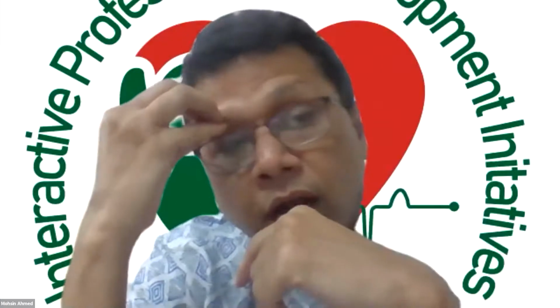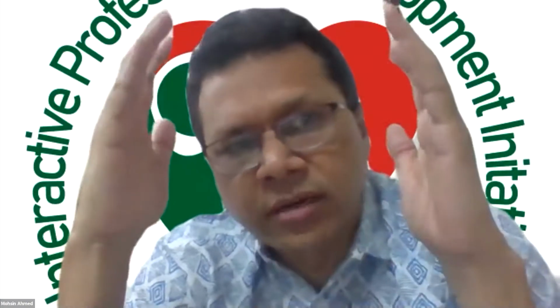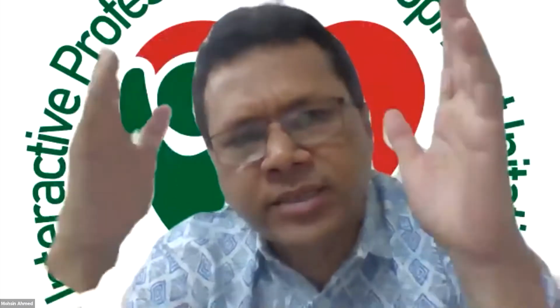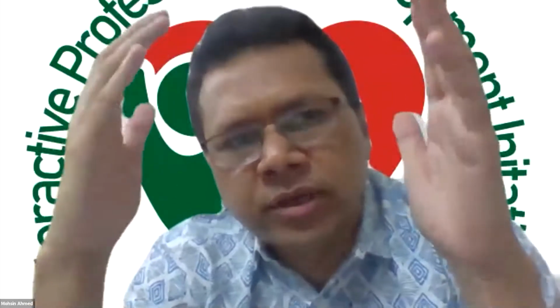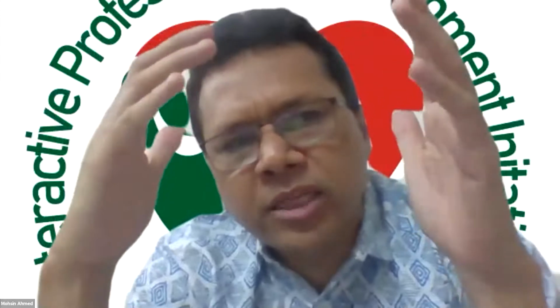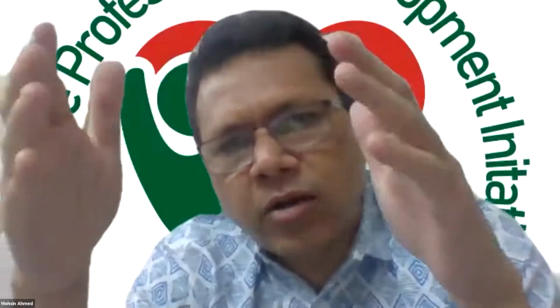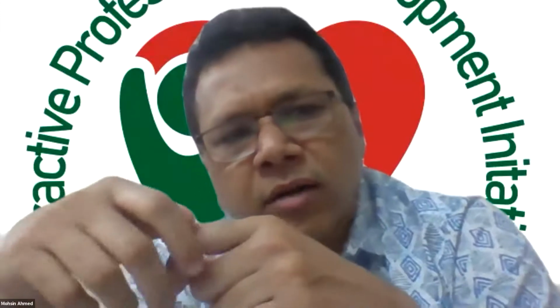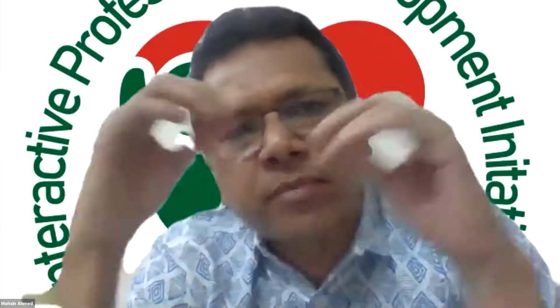Thank you, Kaisar. Another question: the microcatheter is a must in this situation. All operators should use the microcatheter, even in simple cases; you should practice with the microcatheter. Which microcatheters are available in Bangladesh for the fellows? Dr. Arun also showed how to manipulate the microcatheter. Kaisar, with some tips and tricks, how can we use the microcatheter?